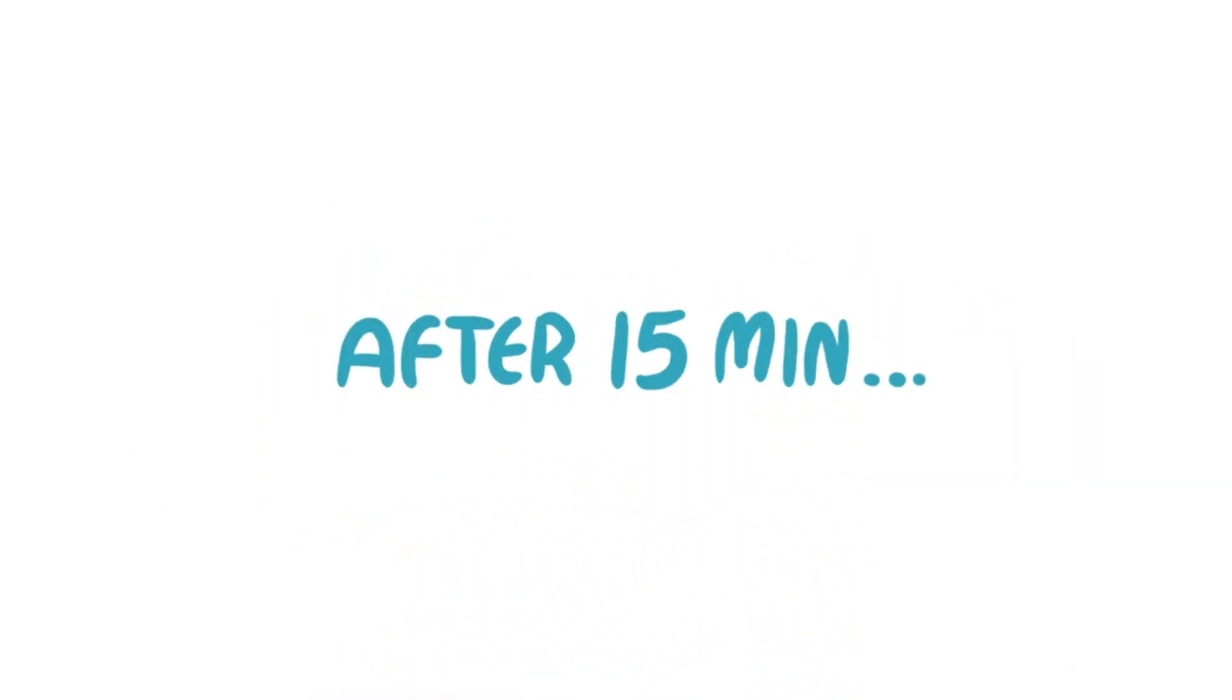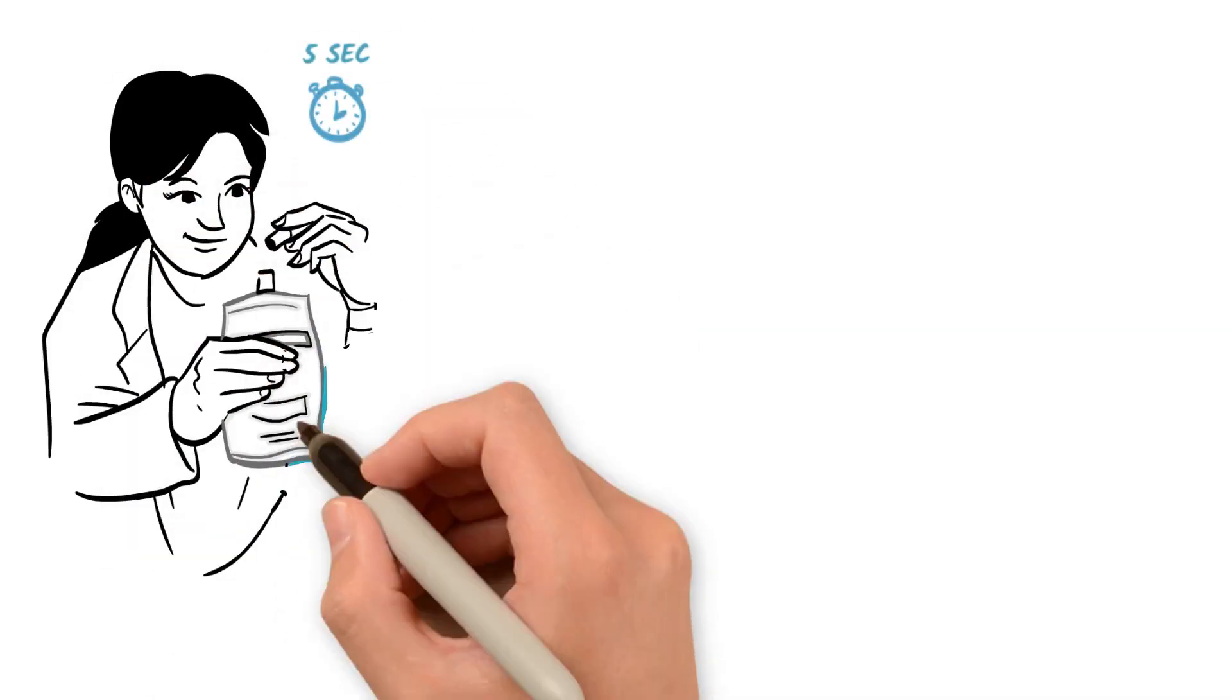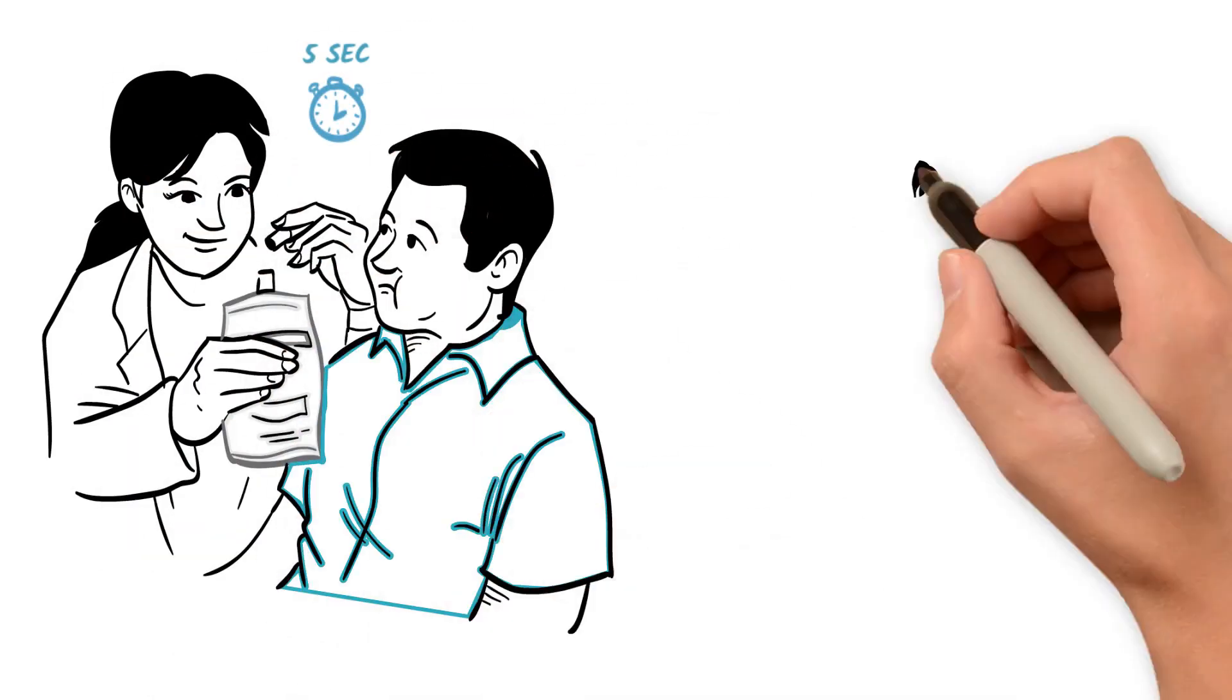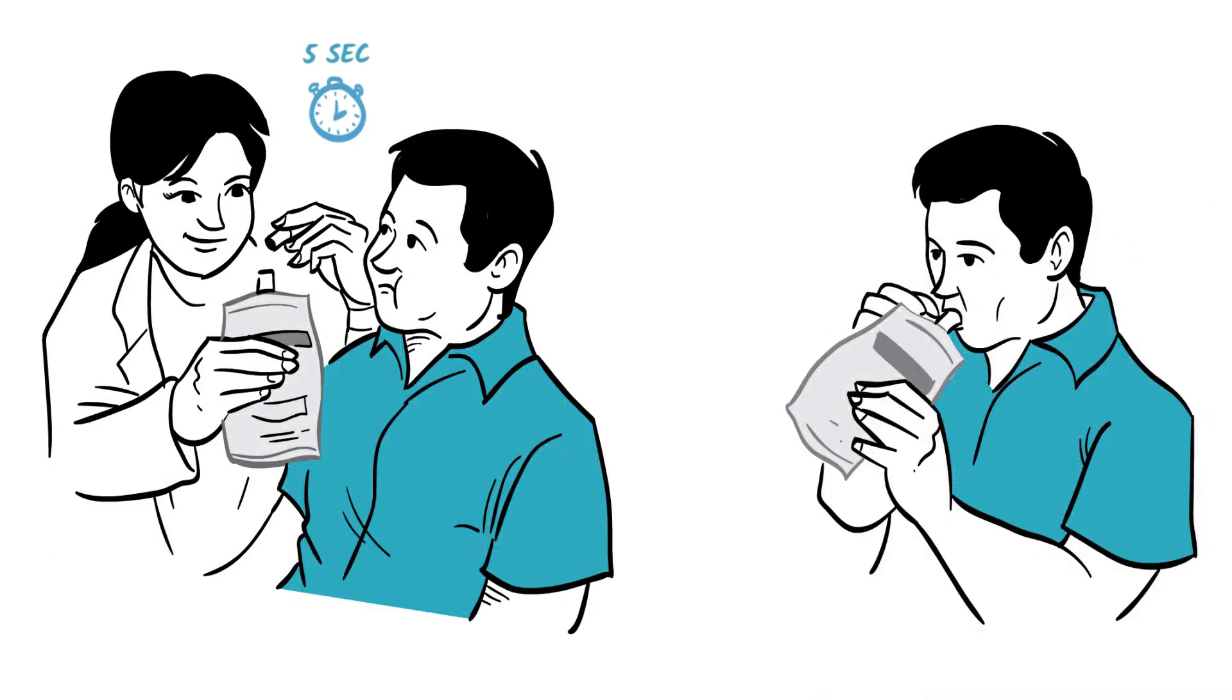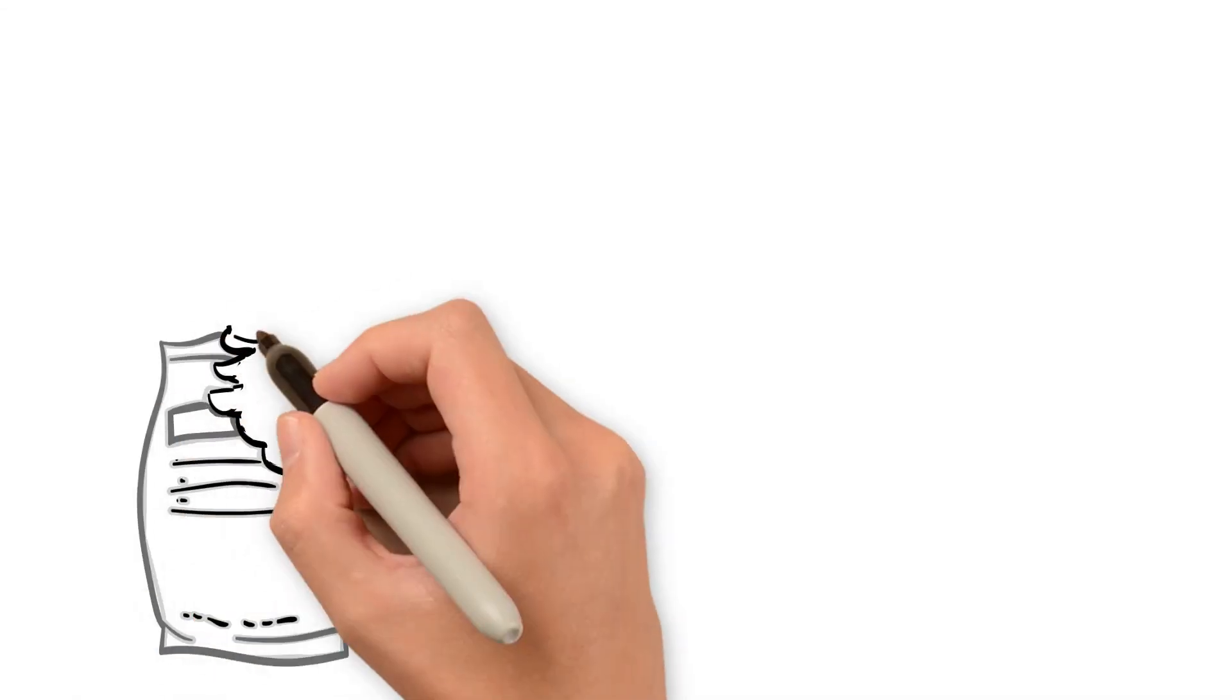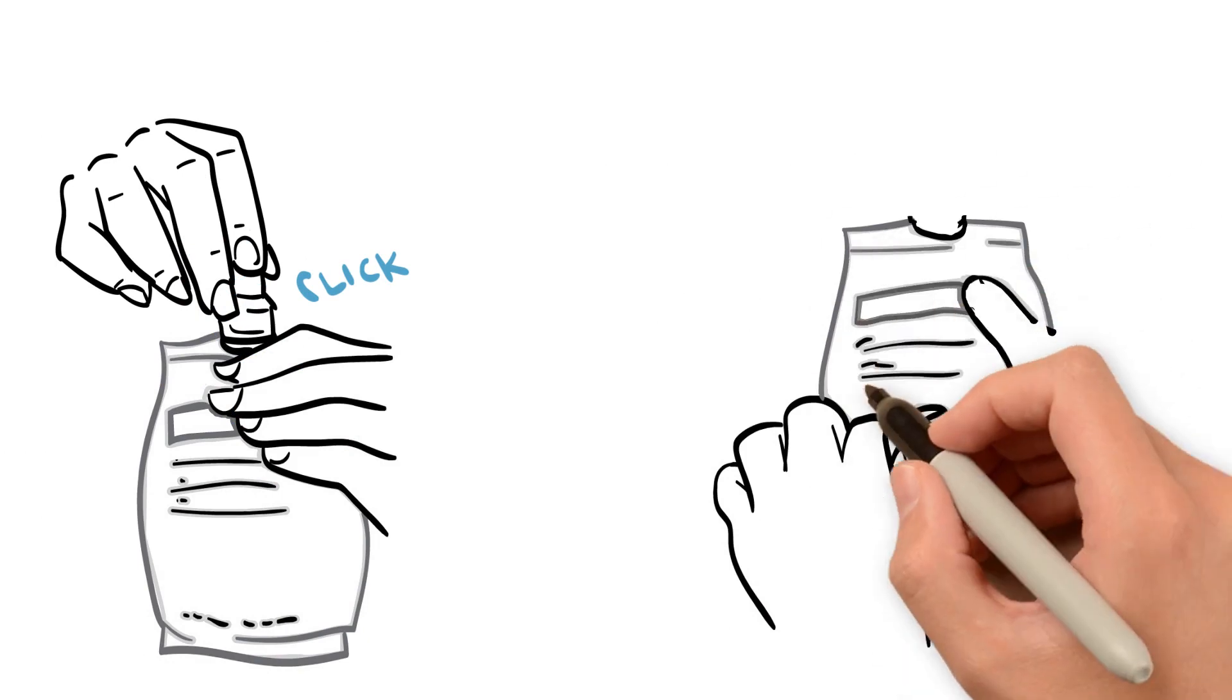After 15 minutes, remove the cap from the gray post-ingestion bag. Ask your patient to take a deep breath and hold for five seconds, then exhale into the bag until it is full. Push the cap shut until it clicks. Mark the gray bag with a barcode sticker.